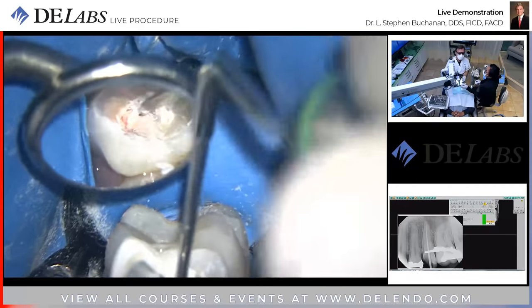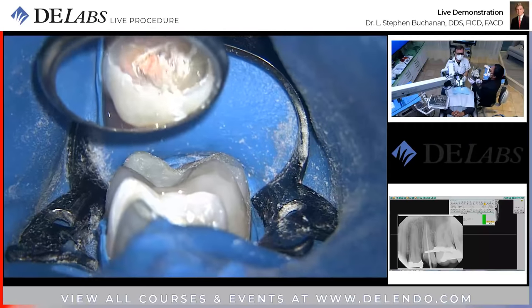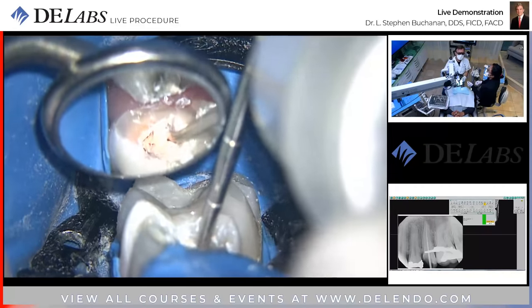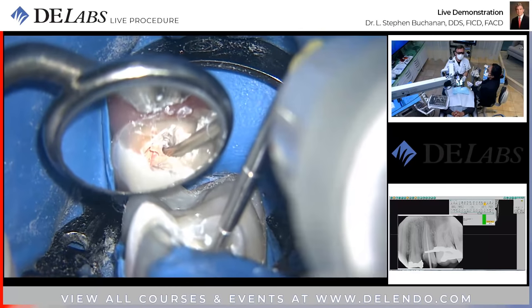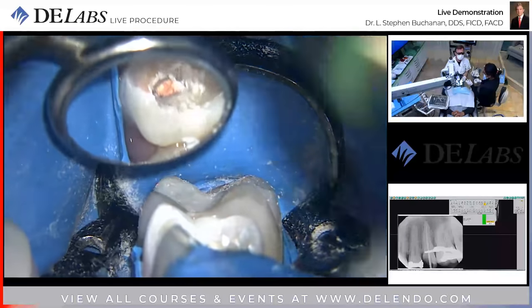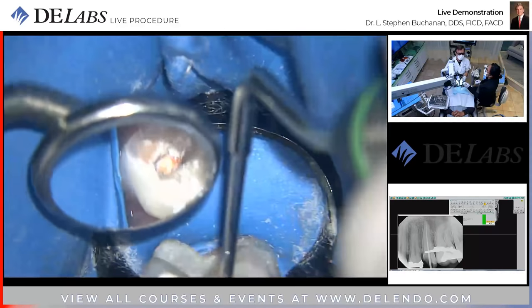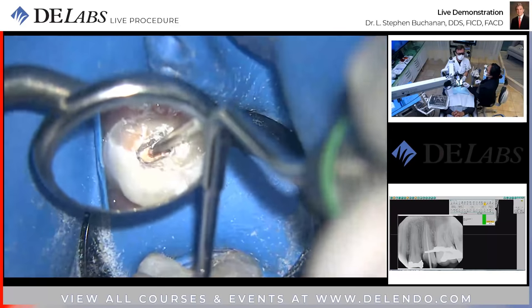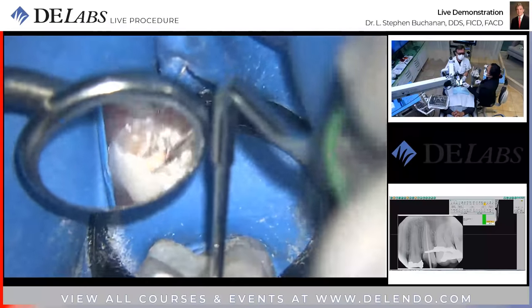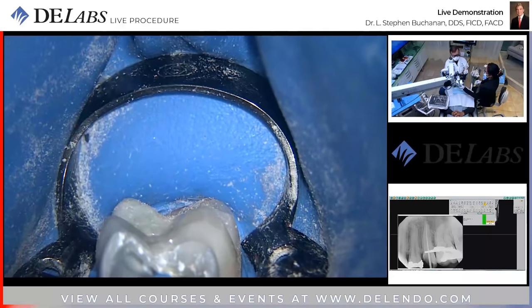One of my friends said, well, there's no evidence-based randomized clinical trials showing it's any better outcomes. And I said, well, we have some really great SEM showing a lack of bacteria, substrate, anything. That's about going to do it for us right here. Let's take a radiograph.